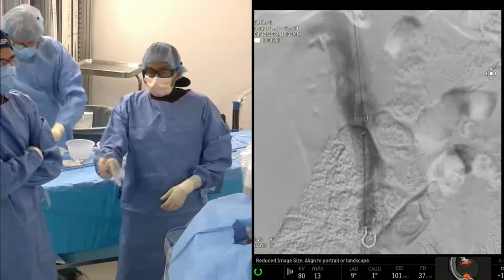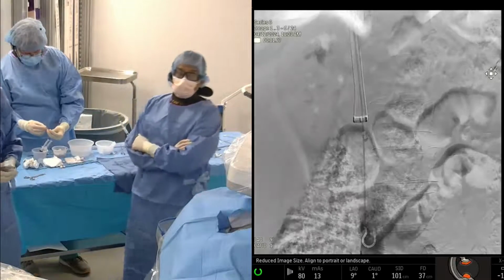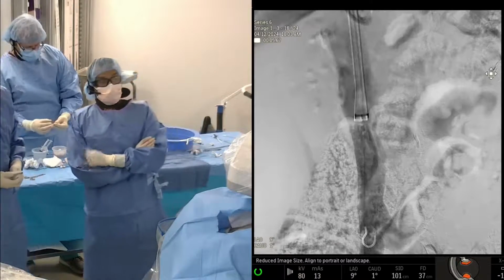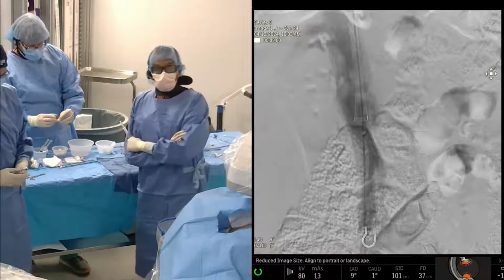Simple questions, like, what are you going to do in terms of removing the sheath? Are you just going to hold pressure, purse string, mattress suture? Usually for these, I just hold pressure and just make sure that they're upright. Yep, and that should be enough for them.